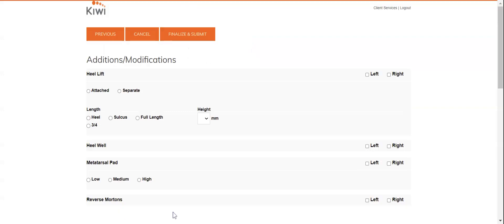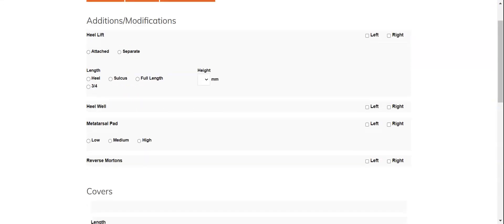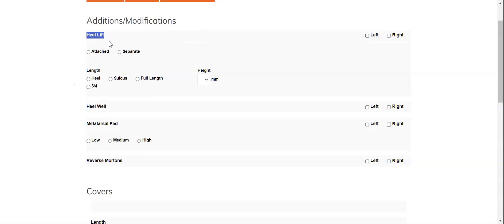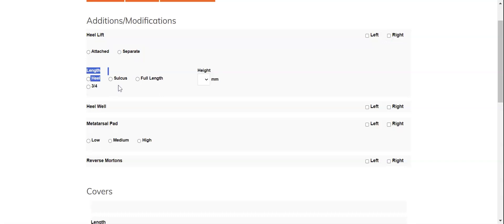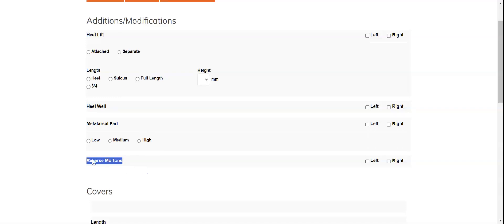Go ahead and click Next and you'll see a stripped down list of our additions and modifications on the next page, with options for attached or separated heel lifts at varying lengths, heel wells, metatarsal pads, and reverse mortens.